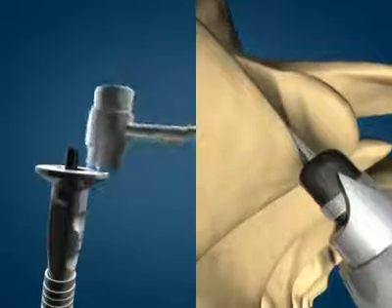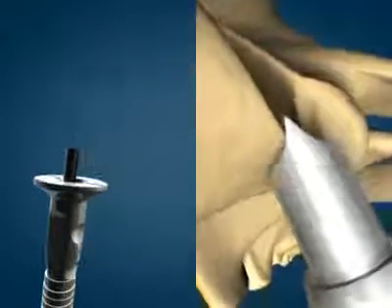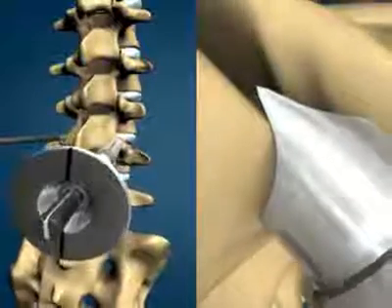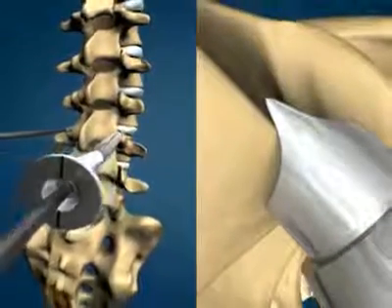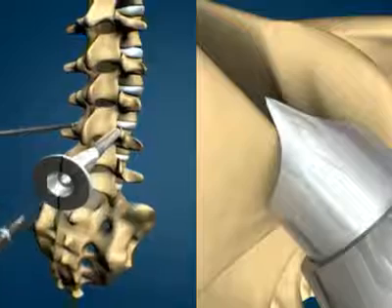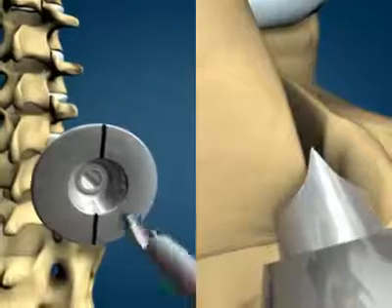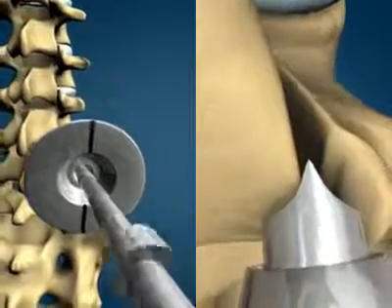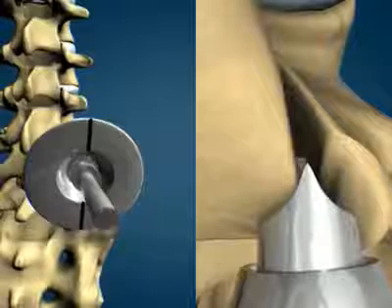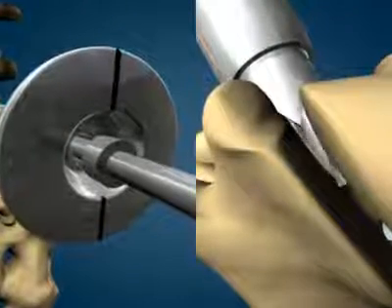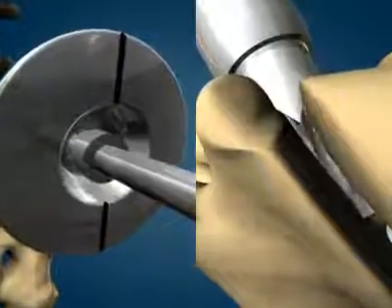Gently tap the drill guide into place. Remove the facet locator. Insert the drill into the drill guide. Drill until the depth stop touches the guide then remove the drill.